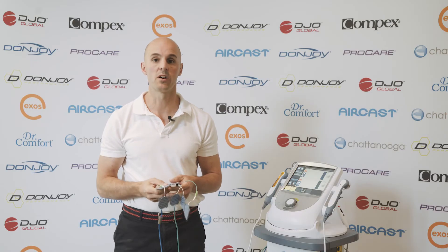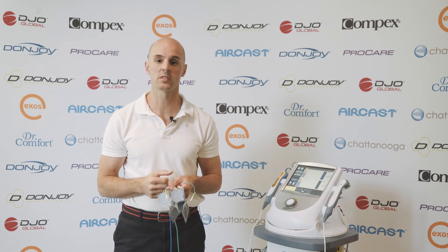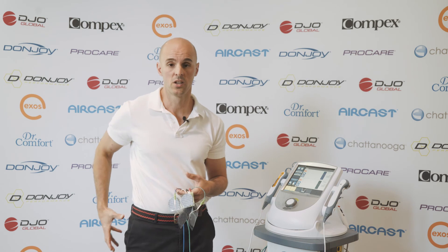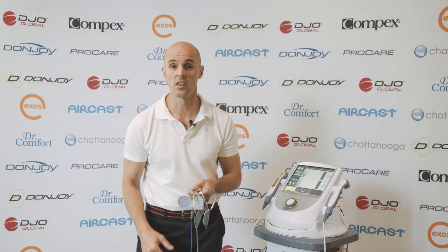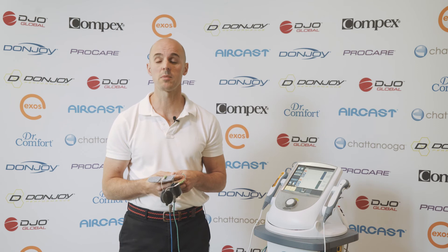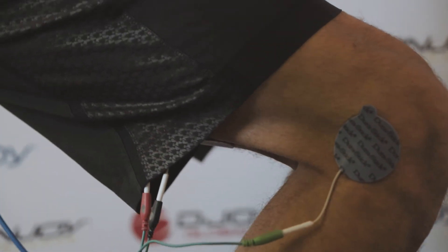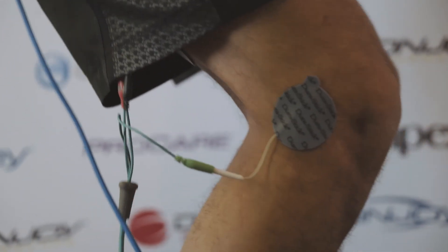So that's EMG biofeedback. If you've had problems in any area — whether it be the shoulder, neck, low back, hips, or knee — and you feel like you've executed a rehab program but haven't got the result you're after, maybe an EMG assessment might be the way to have a closer look at how we could refine and tweak your programming, so you're getting the best out of it.